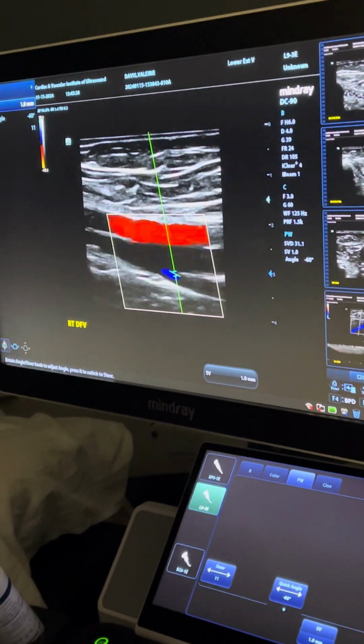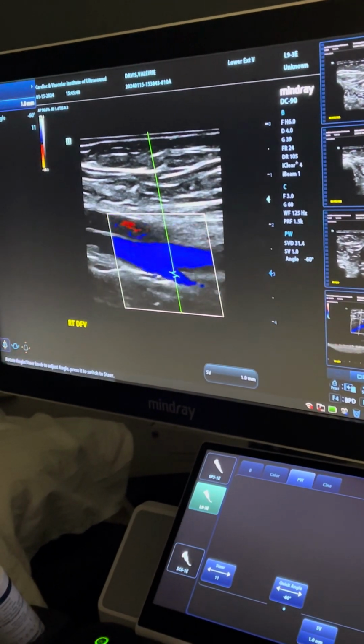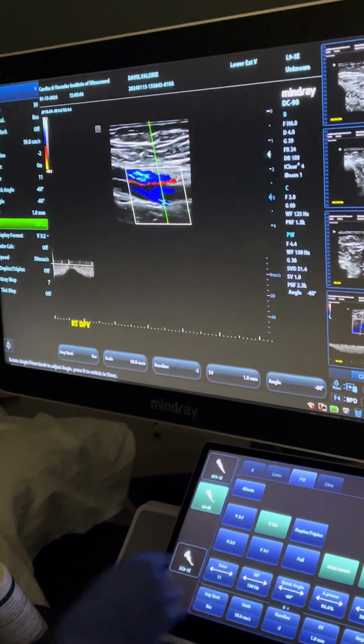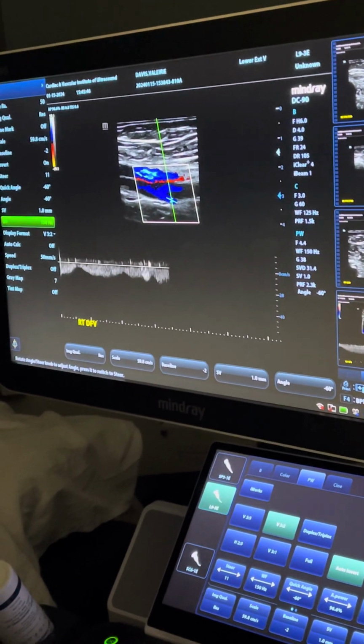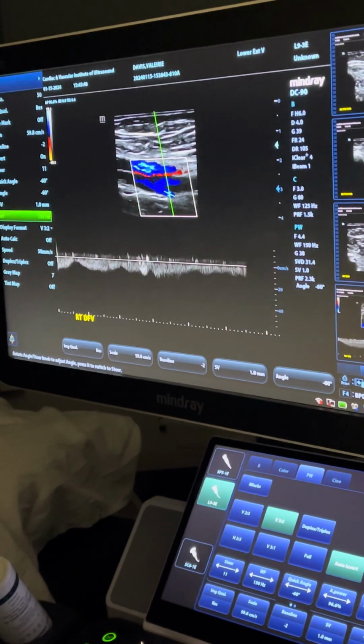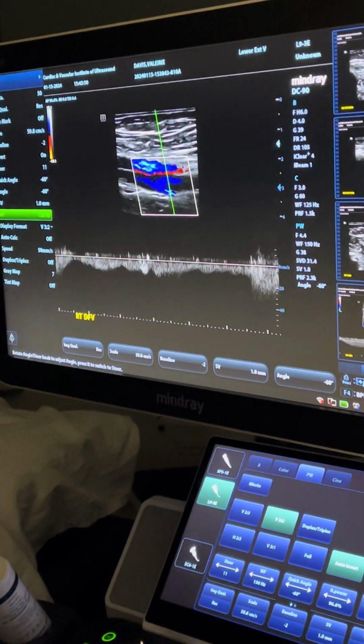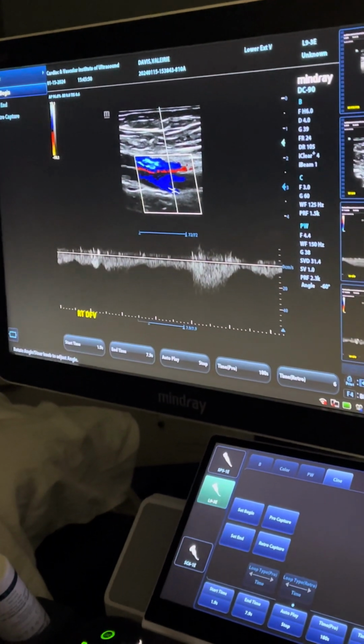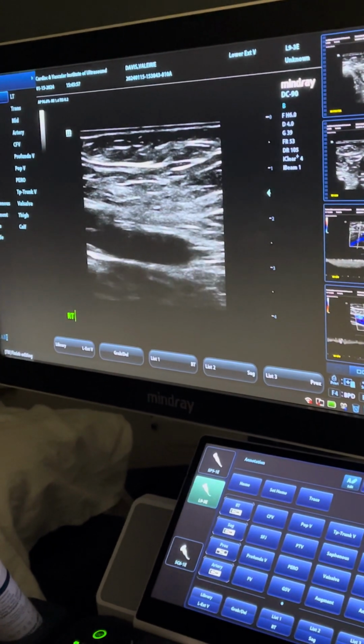So you see how the blood flow is kind of filling in and then not? Why is it doing that? I'm breathing. That's exactly right. Whenever I reach to squeeze, I'm reaching up underneath my arm. I'm not going over my arm.